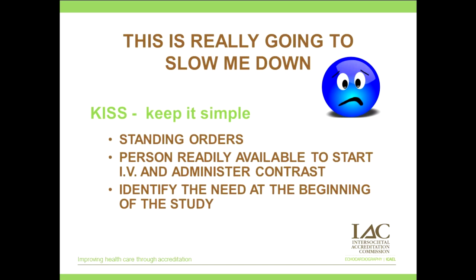Why? Well, there's 2 reasons. This will first help to get the personnel ready, the personnel that are responsible for your IV starts and administration. Round them up so they'll hopefully be ready when you're at the end of your study, so they can help you and assist you in administering contrast and starting the IV. Also, knowing that you'll be using contrast at the end of the study, you don't need to take all that special extra time on trying to image the left ventricle for those function images that are used for your biplane EFs and assessment of wall motion abnormalities.